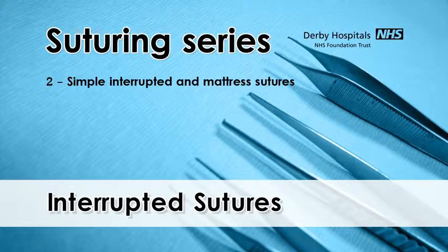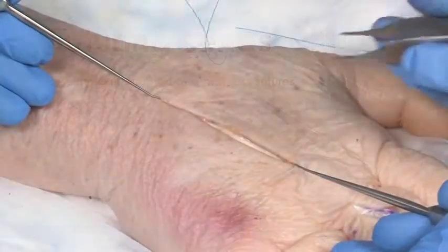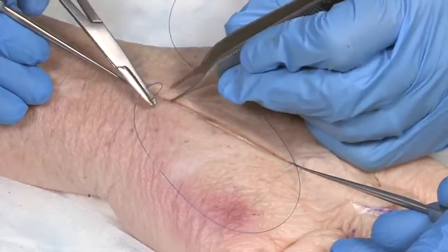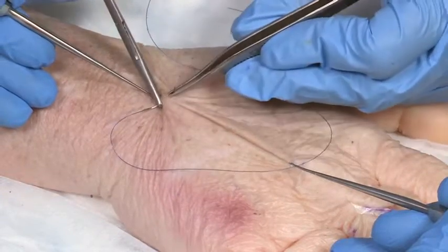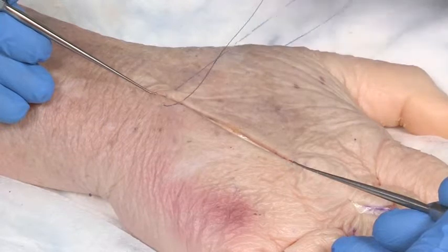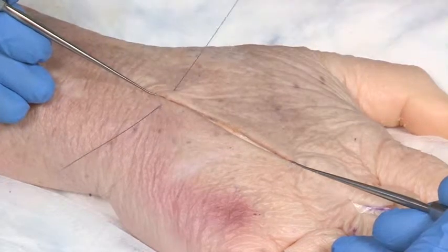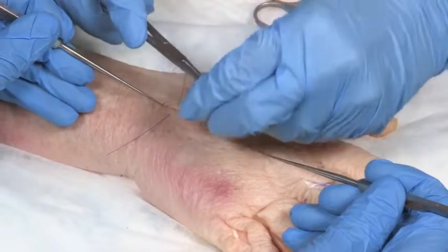Interrupted sutures with instrument tie. Ensure the wound edges are appropriately positioned. In this case, we've used skin hooks to approximate the edges. Insert the needle perpendicular to the skin and use a smooth movement to pass the needle through the tissue, rotating your wrist. The distance from the edge of the wound should correspond to the thickness of the tissue being sutured. Each suture should be passed approximately twice this distance from the last.